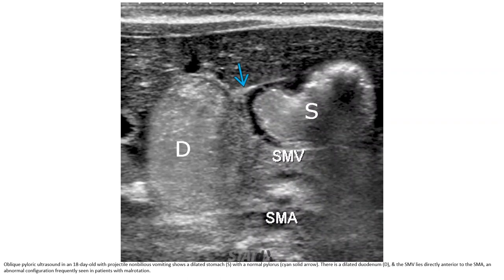Pyloric ultrasound in an 18-day-old with projectile non-bilious vomiting shows a dilated duodenum, with the SMV lying directly anterior to the SMA — an abnormal configuration frequently seen in patients with malrotation.